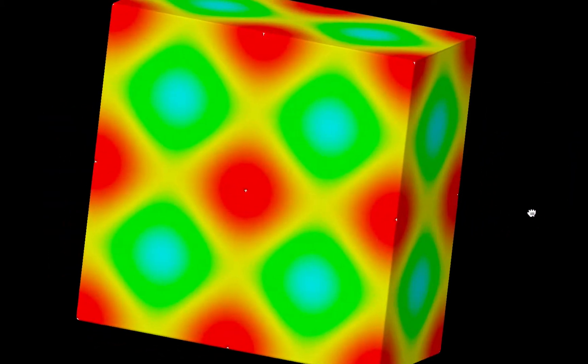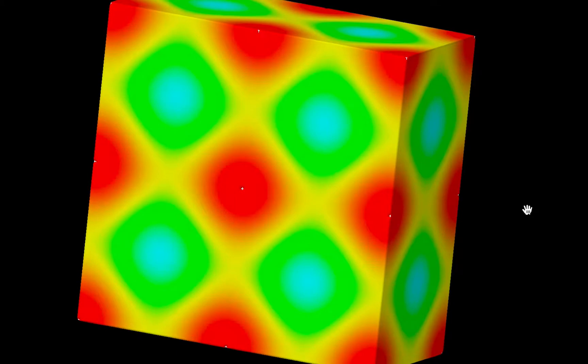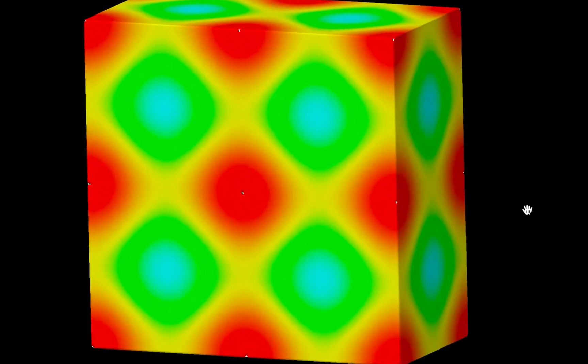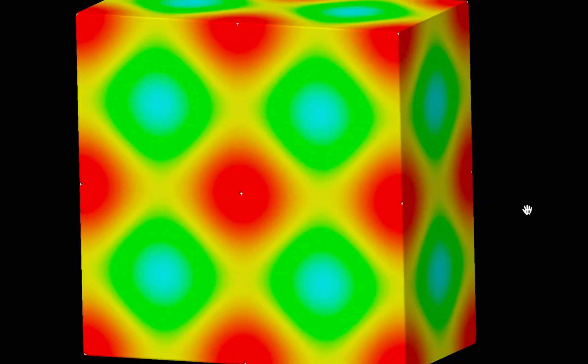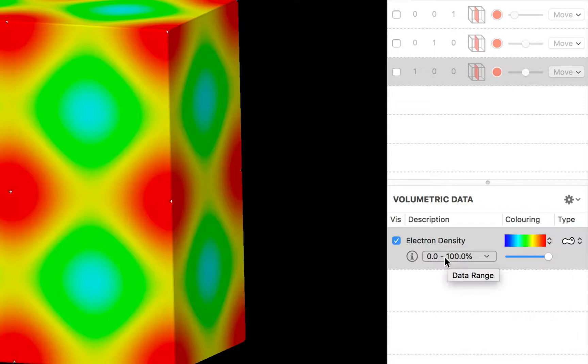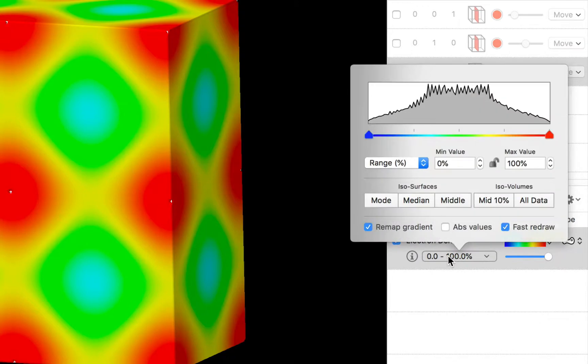Now we can customize that range very easily using the controls in the volumetric data list. So if we move down here where we have our description of our data set we have a little button that says data range. So we'll click this button and we get a pop-over.